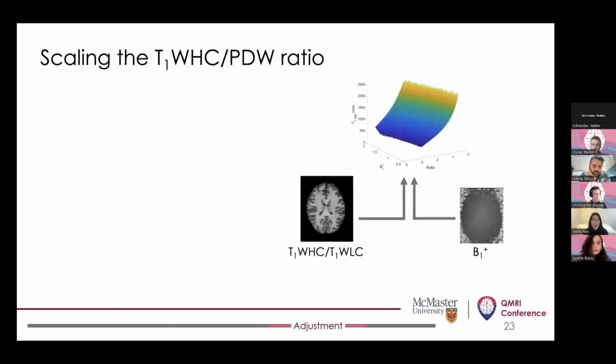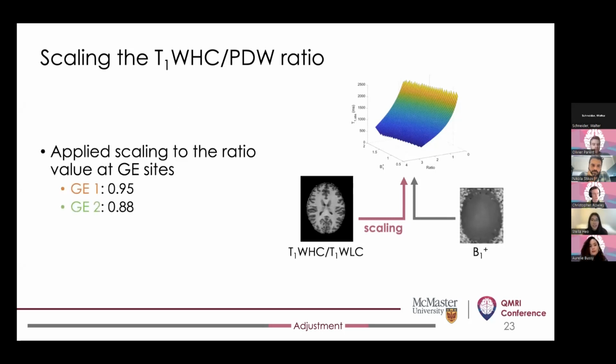So to play around with this notion, we tried to globally scale the ratio values between the two T1 weighted images using site-specific scaling factors just to see if that could somehow reconcile the intersite differences that we observed. We tried a number of global scaling factors for each site, and through visual inspection and trial and error, found that these scaling factors listed here led to considerable overlap in ROI R1s across sites.